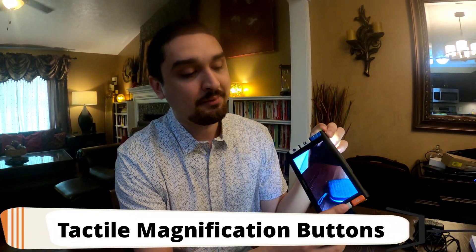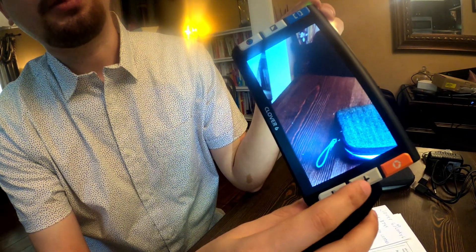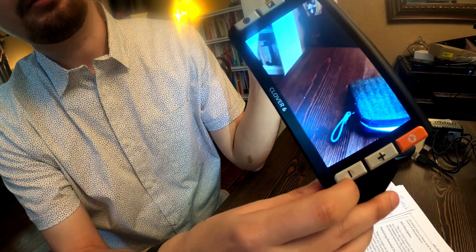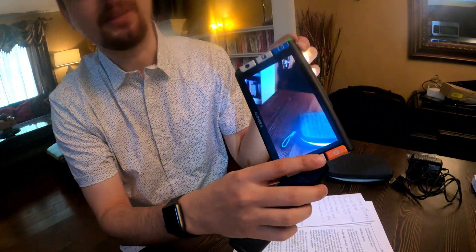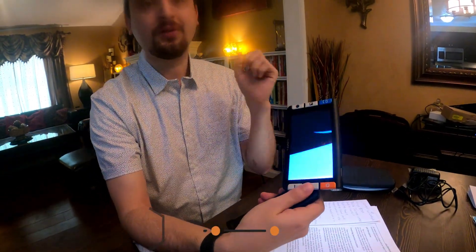The plus and minus magnify buttons have some tactile feel to them. The plus has a bump dot in the middle and the minus has a little recession, so you can feel tactilely which one you need. This will go up to 35x according to the manufacturer's website. You're not going to be able to read anything very well at that level — you may consider a CCTV at that point — but it will go super high.